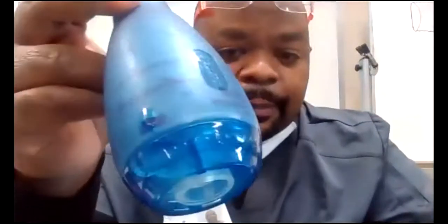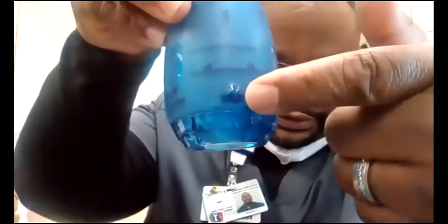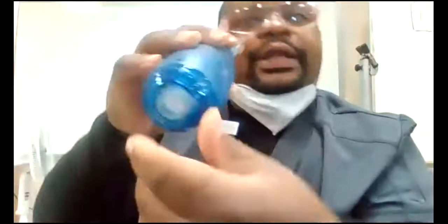There's a dial on here that I can turn that makes it harder or easier. I can turn this to make it more pressure or less pressure, either a really hard thump or just a little bit, depending on how strong the patient is, okay? But this is a flutter device called the Acapella. This is just a brand of a flutter device.